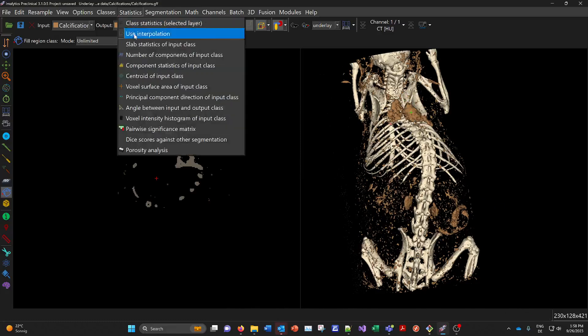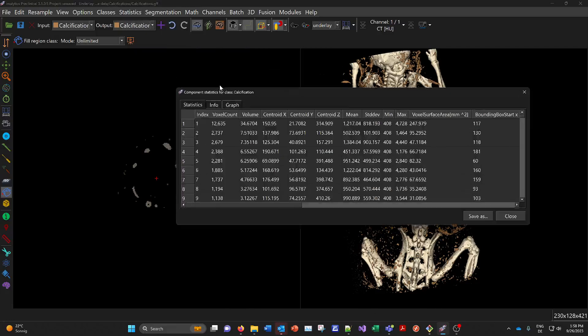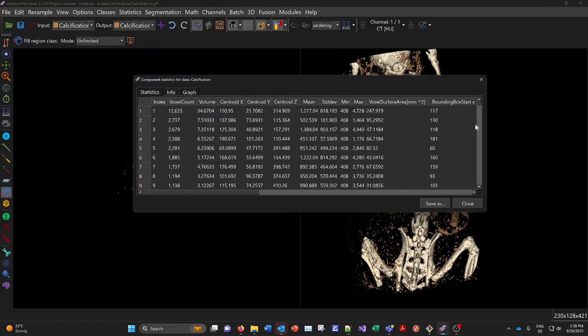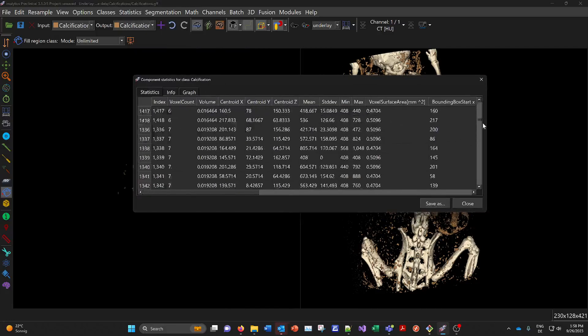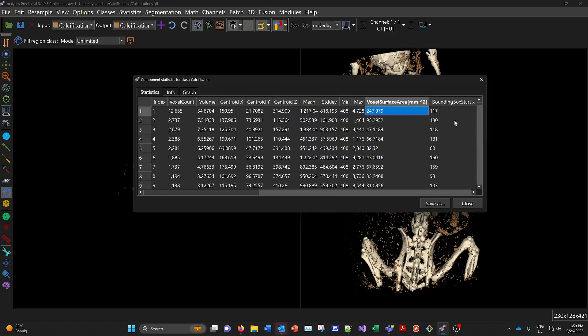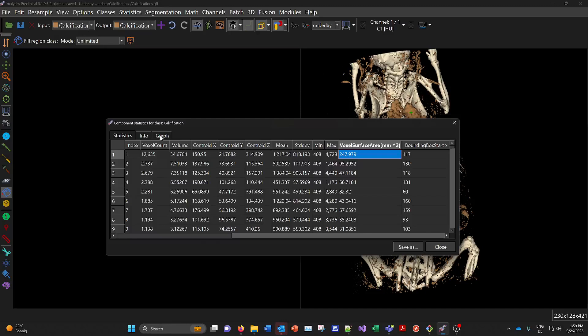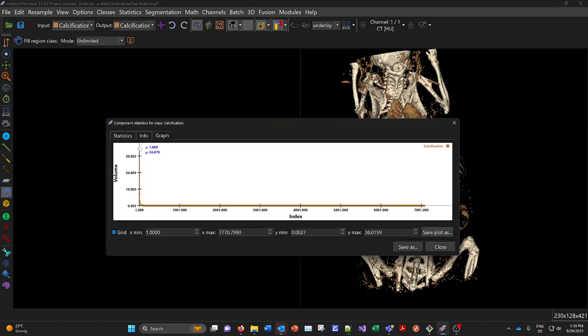And you can get more detailed information here using the component statistics. And you get a huge table here with 7000 rows sorted by size. The biggest one has this volume here. So it's one row per connected component of the input class. Here the calcifications. And here you see a graph. It's like a histogram. So it's the volume sorted over the index of the component.